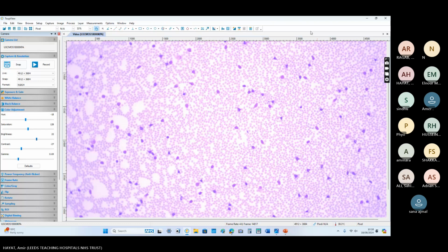Yeah. So this is a 58-year-old male who went to GP for routine blood tests, and the GP noticed that the white cell count is high, 76, and he asked for the blood film of this patient. Then the biomedical scientist or the lab scientist called that he is seeing some abnormal cells in the blood film which looks like leukemia.